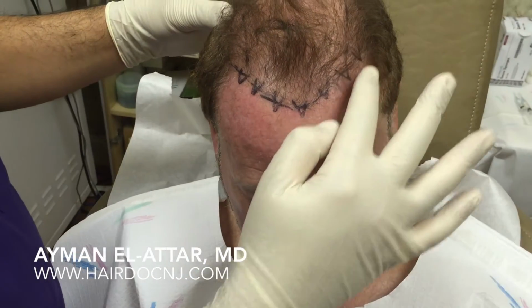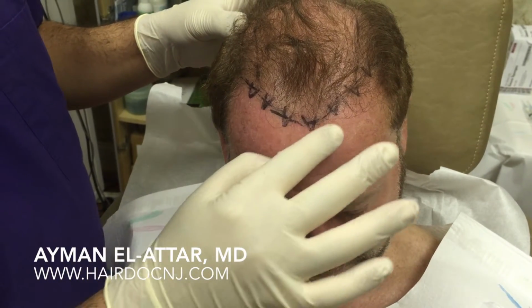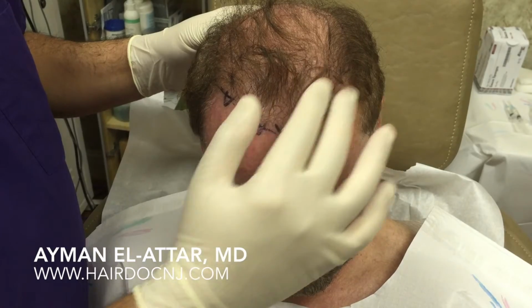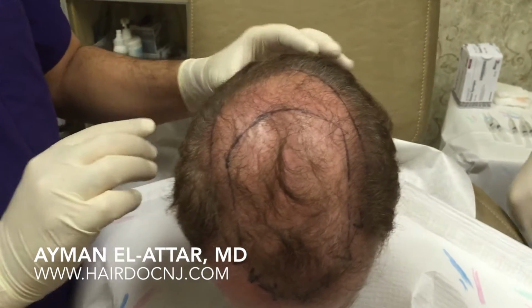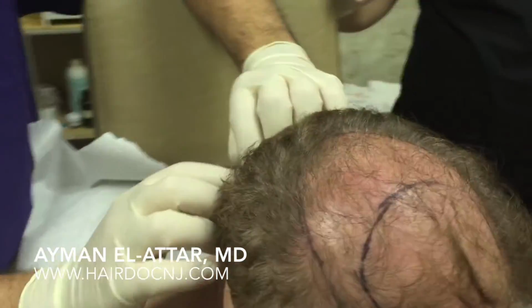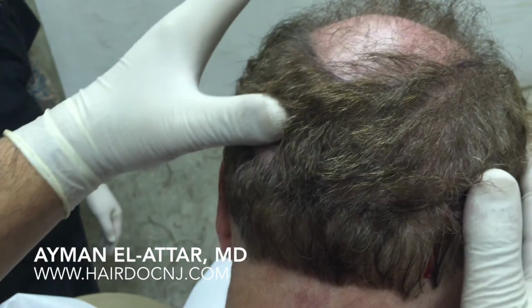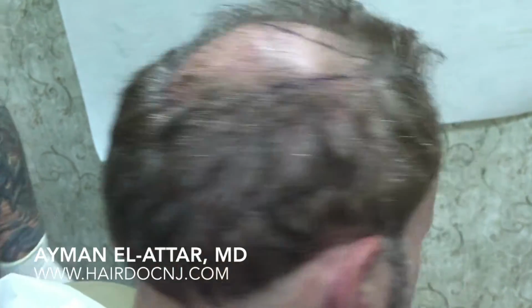The other thing is that after we do the hairline design, we have to do the hair placement in an irregular fashion, like a zigzag or a little bit of islands. In his case, we're going to do replacement and increase the density of the vertex, as well as the baldness in the posterior end. We actually just removed the strip recently, and we closed, turn your face this way, with trichophytic closure. You can actually see the incision line, and we just cover it with hair, so when he walks out of the office, it's as if nothing happened.